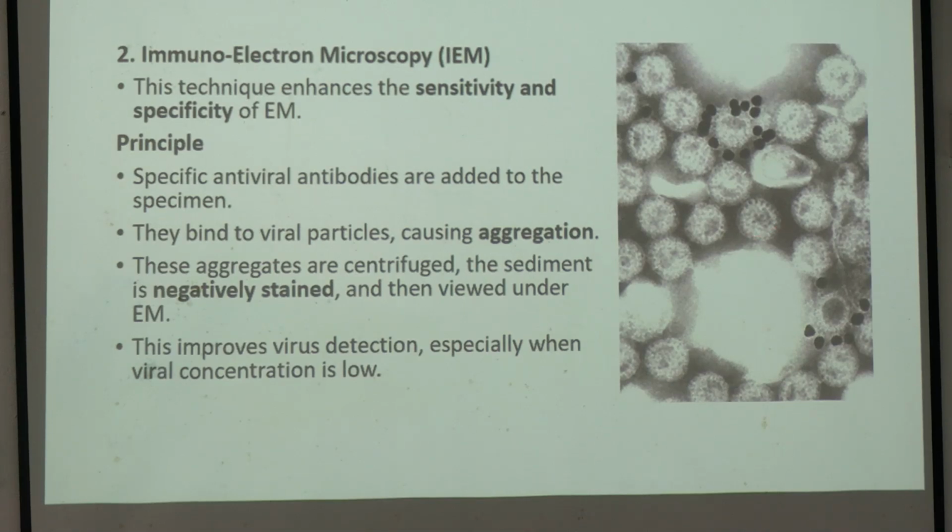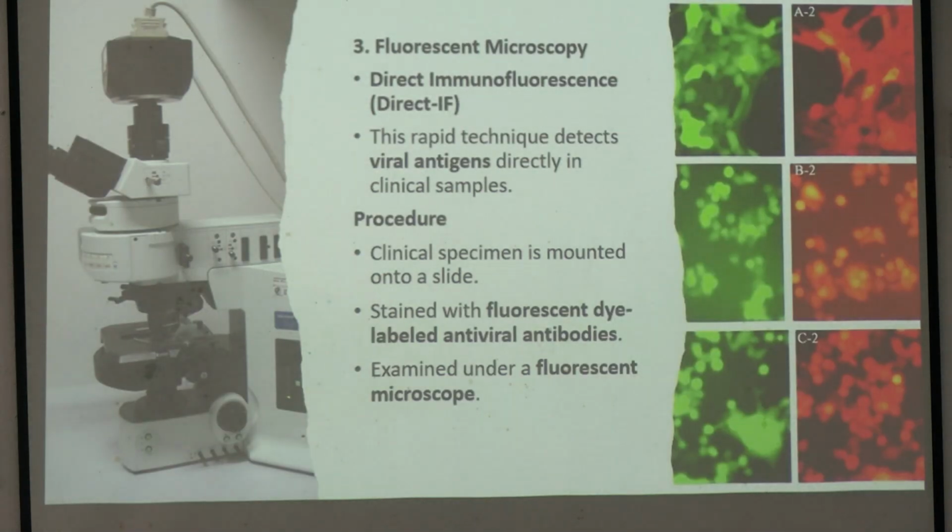বুঝা গেল? So, anything which is immune tagged means একটা কিছু foreign particle আছে, সেই particle এর সাথে আমি একটা antibody add করছি, সেই antibody টা আমি sample এ দিয়ে দিলাম। Sample এ দেওয়ার পরে কি হলো? Sample এর মধ্যে যদি antigen থাকে, automatically the antibody binds with the antigen, আর সেই binding টা হলে we can locate the external particle that we have given, the gold nanoparticle. This is the principle of many tests, immunochromatography test আমরা এই same principle এ করি.